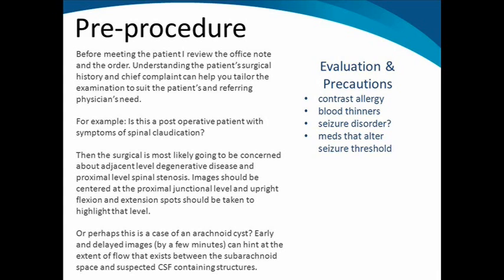Is there adjacent level disease? Is this a postoperative patient with spinal claudication? I review the patient's allergy history and make sure they're not allergic to X-ray dye contrast. Iodinated contrast is what we typically use for myelography.